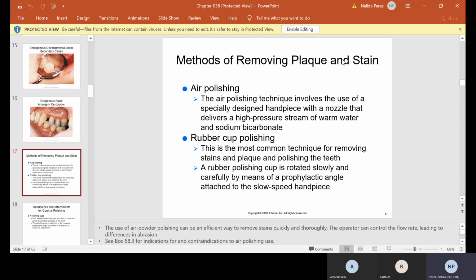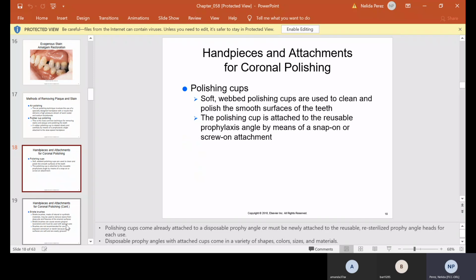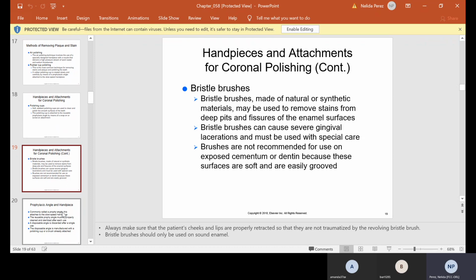Rubber cup polishing, this is the most common technique for removing stains and plaque and polishing the teeth. It's rotated slowly and carefully by means of a prophylactic angle attached to a slow speed handpiece. So really important, you attach the prophy angle to a slow speed. Polishing cups, soft web polishing cups, are used to clean and polish the smooth surfaces of the teeth. The polishing cup is attached to the reusable prophylaxis angle by means of a snap-on or a screw-on attachment, which I showed you earlier in the PowerPoint.